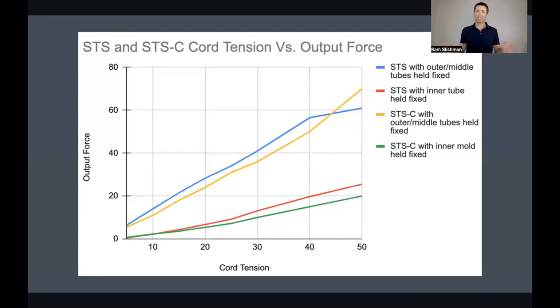It doesn't matter. So the KTD works. It doesn't take a whole lot of force to traction a leg. 5 to 15, 20 pounds of force usually gets the job done. So this is why I call the topic of mechanical advantage a false feature. Don't get hung up on those numbers. I think the answer for ours is actually pretty similar to the CT6. It's somewhere in here, which is roughly 1-to-1, but it just doesn't matter. It works.